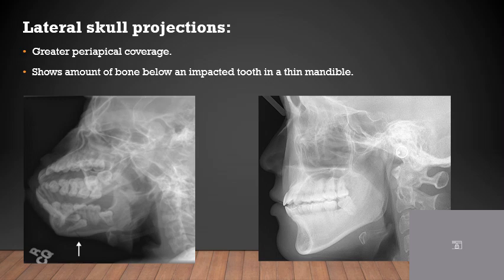Lateral skull projections. So what are these? Lateral view, lateral skull view. It is done prior to a panoramic radiograph where not locally available. So when was it done? Before the advent of OPG, this was ideally done to view the mandible. That was the only option for viewing mandibular impactions that could not be seen through intraoral radiographs.